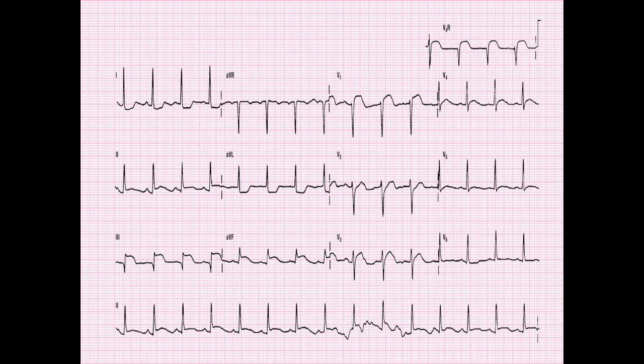So I've got this patient here. I'm doing my 12 lead, lead 1, depressed. ST segment depression, I should say. Lead 2, elevated. Lead 3, elevated. AVL, depressed. AVF, elevated. V1, a little elevated. V2, normal. V3, a little elevated. V4, maybe a millimeter of elevation. V5, V6, normal. But I see this elevation in 2, 3, AVF. I've got reciprocal changes in 1 and AVL.